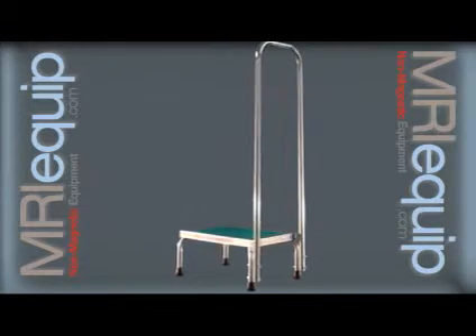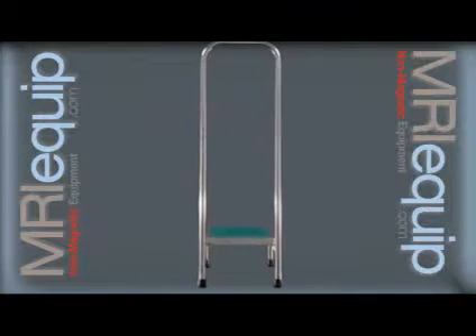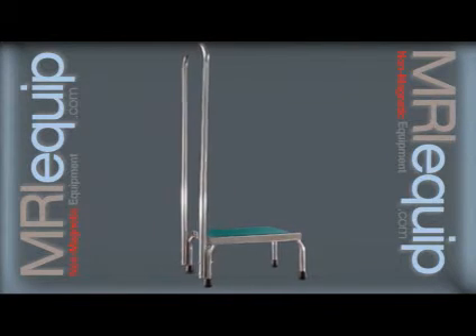Perfect for helping patients get on and off your MRI bed, your patients will thank you for the extra step and you'll be thanking yourself for the extra help as well. This stool has a 16 by 12 inch base with an 8 and a half inch step height.